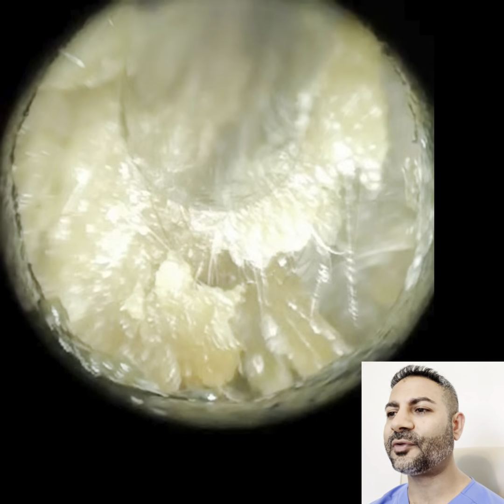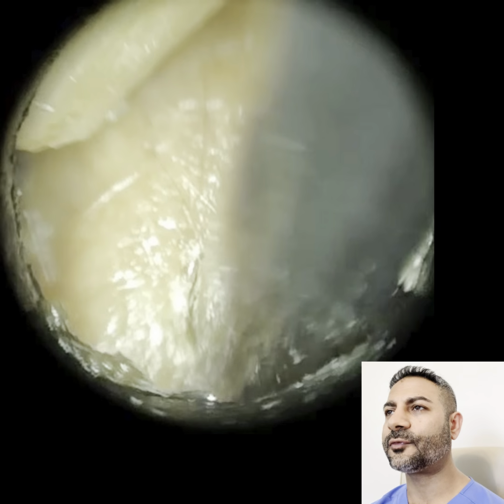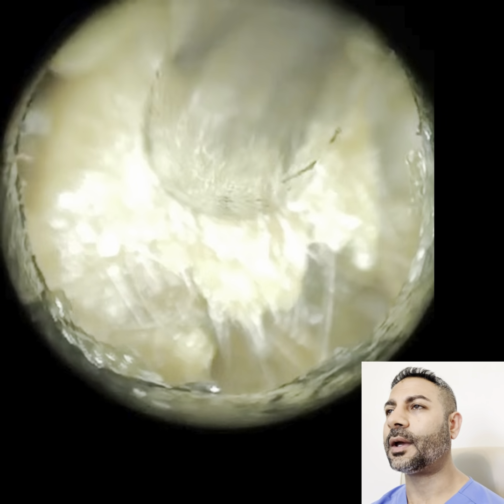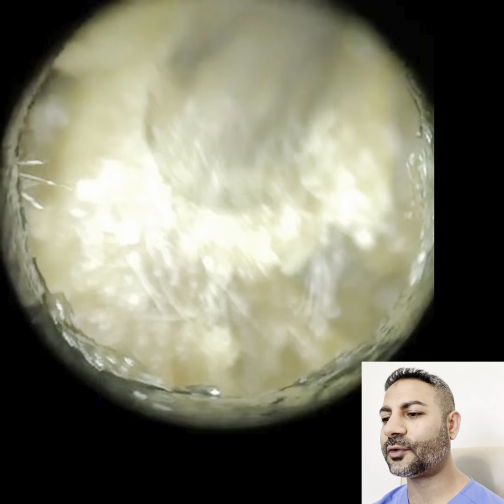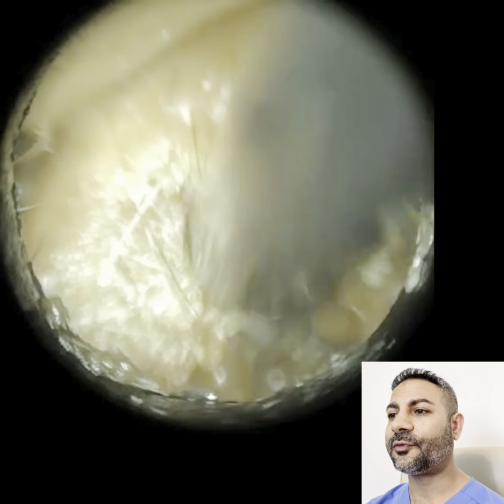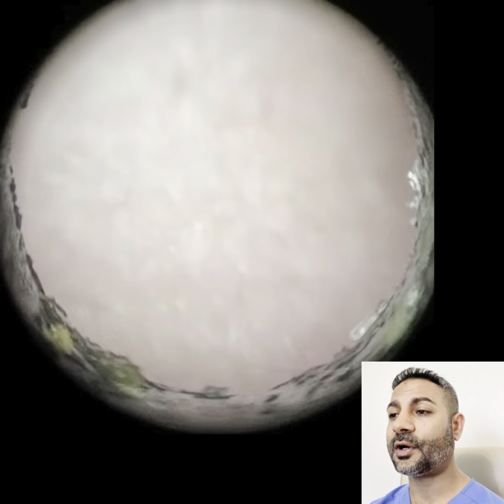It's never 100% accurate, but more often than not it is. And the science and physics behind it is just amazing. Have I got time to explain it? Possibly. But yeah, so I did a pressure test, and actually it showed that their left ear was fine. The pressure behind the eardrum was fine.